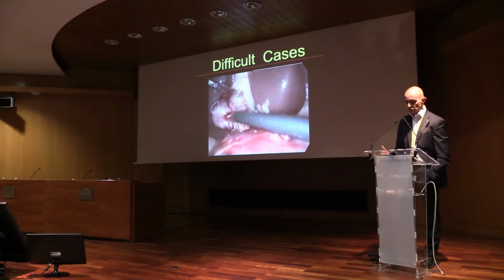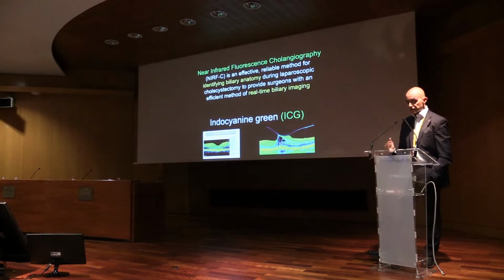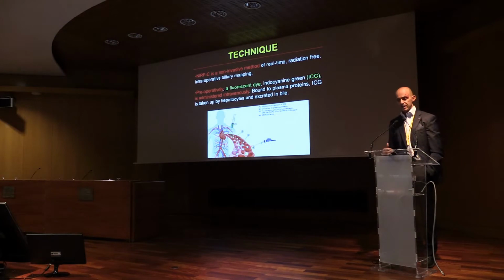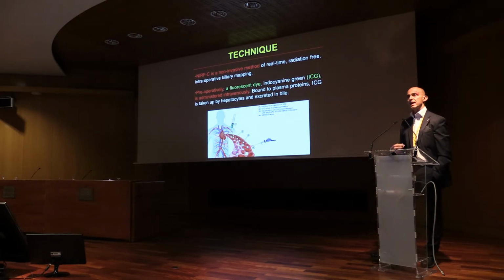Thanks to ICG, you have the possibility to do this: real-time biliary imaging. It's important to standardize the injection because to identify the gallbladder you have to inject the day before, because the dye is taken up by albumin, then goes into the liver and then into the biliary tree. If you inject a few hours before, you can see the liver green and you do not have a good view. For this reason, it's preferable to inject the day before.